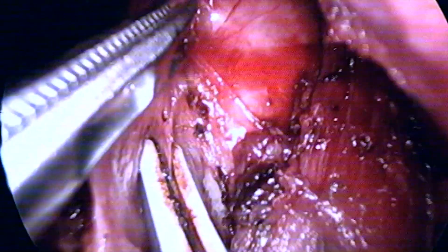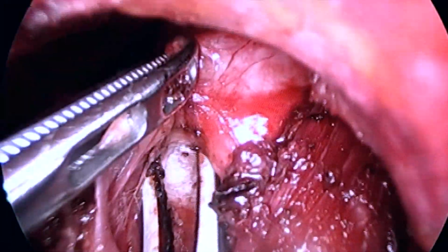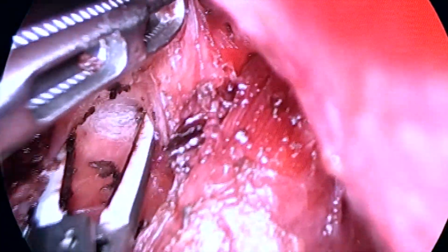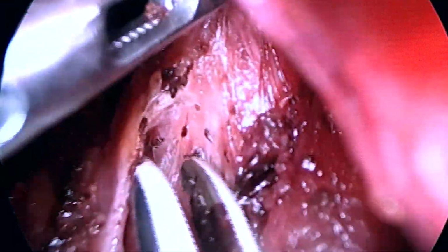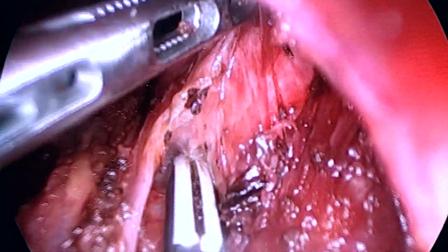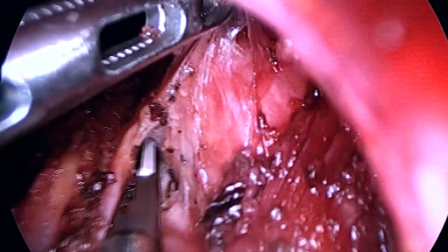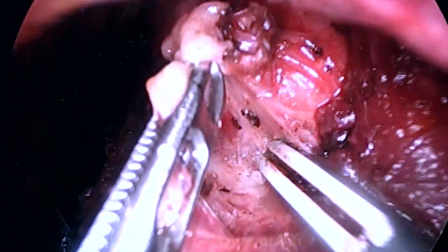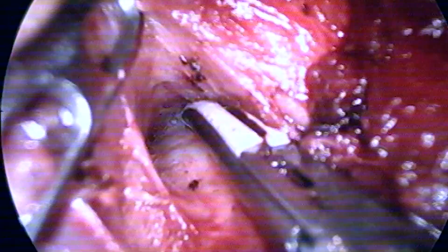This is followed by a more medial dissection in the avascular plane to expose the anterior tracheal wall. An energy device is very handy in this situation for dissection and maintaining the hemostasis.